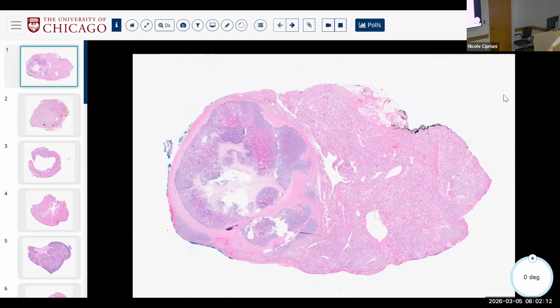We know, however, that the biopsy findings from FNA, the Bethesda category, and the molecular findings that may or may not have been present on the molecular testing from the FNA could inform our diagnosis. So when relevant, we'll also talk about those findings. Does anybody have questions or comments or clarifications from anything before we start? From the lectures or from the recordings? Okay. All right. So case one.